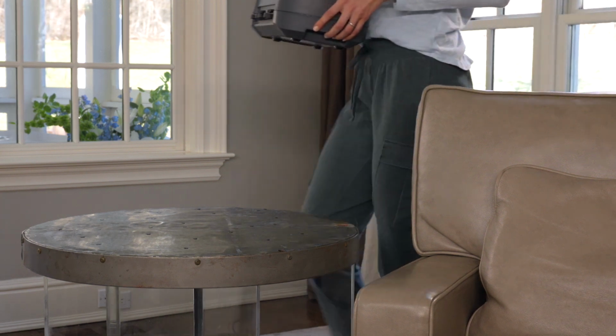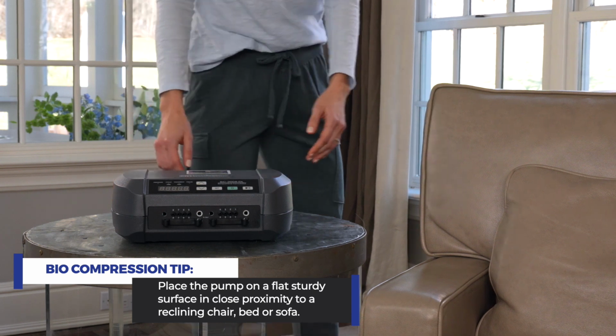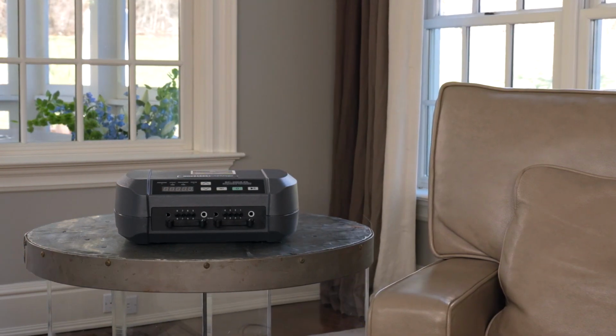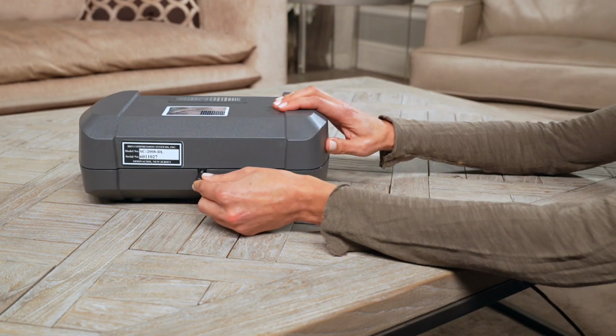Choose a location to set up your pump. Place the pump on a flat, sturdy surface in close proximity to a reclining chair, bed, or sofa where you will be comfortable during treatment. Attach the power cord to the back of the pump and then plug it into an outlet.